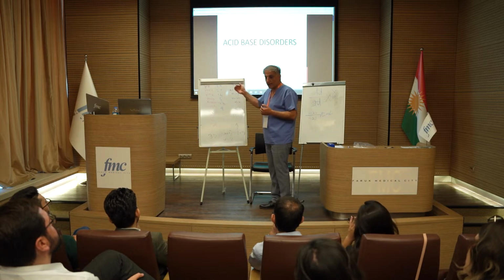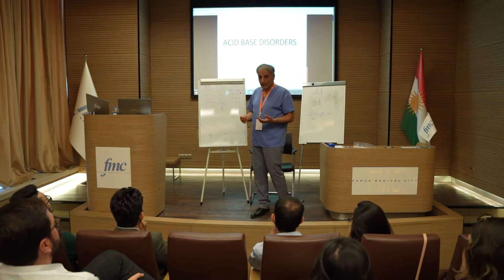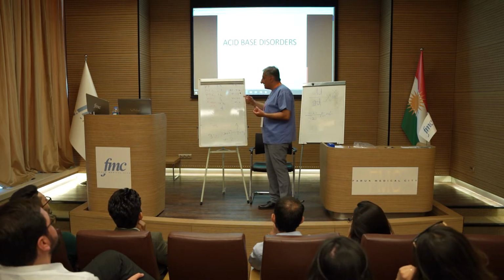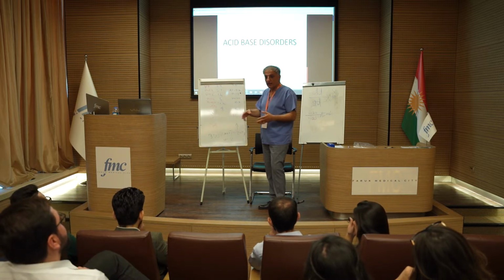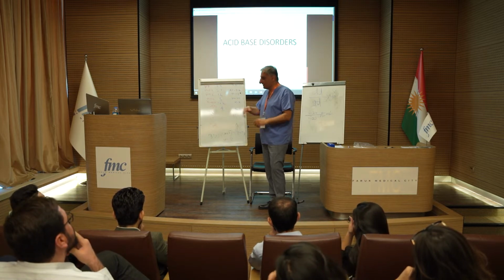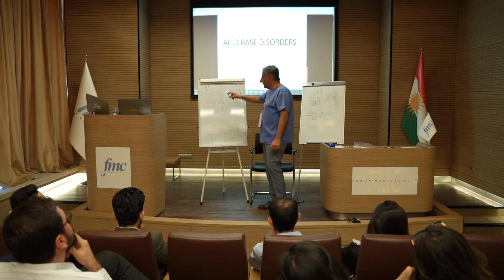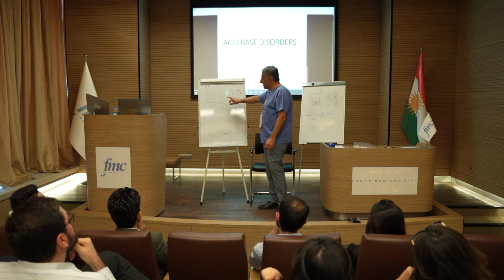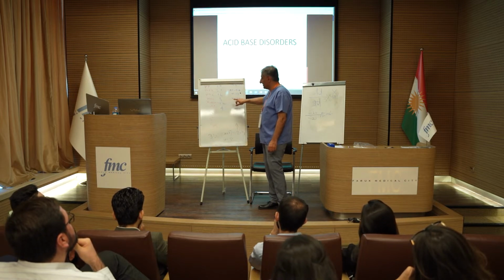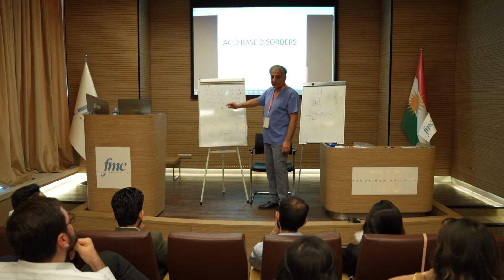So we look at the pH. pH is low, so she's acidotic, acidemia. She's trying to compensate for that by hyperventilating, to get rid of a lot of acid, which is CO2, to compensate for the acidosis. But obviously that's not working. As part of the acidosis, she's losing a lot of bicarb. Instead of 22, it's only 8, and there's a minus 17 base deficit.